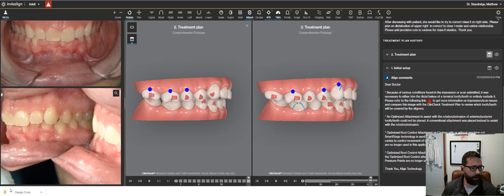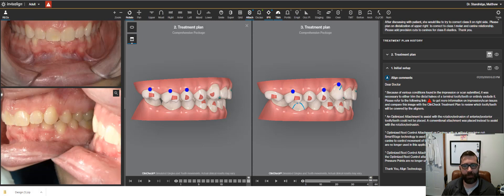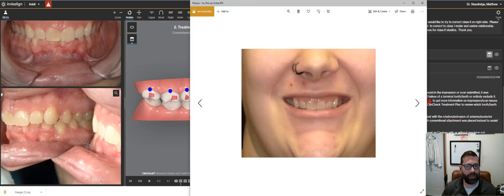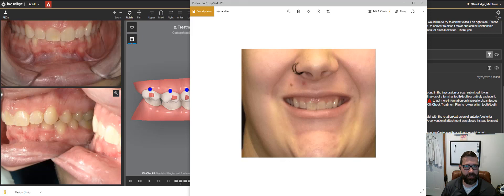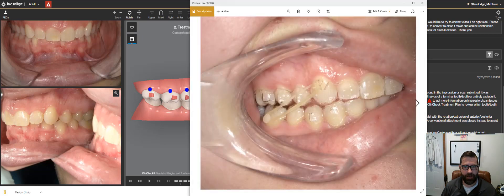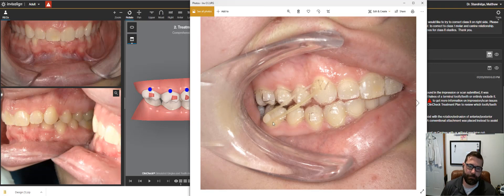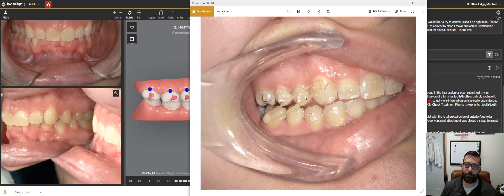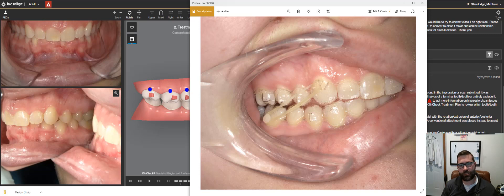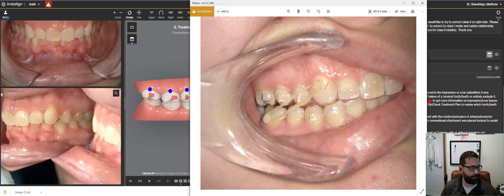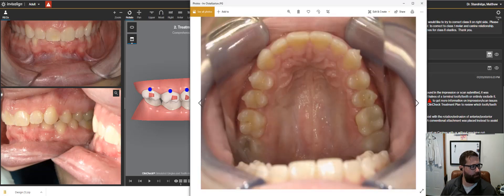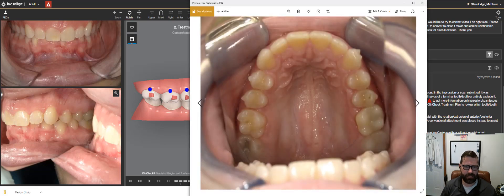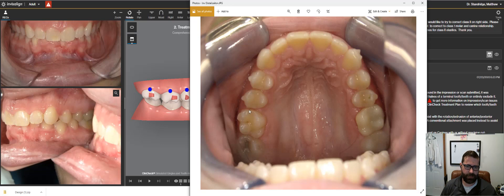And then let me bring up a photo. Also, we're going to be opening the bite by intruding these front teeth. Here's a smile. Right? And then here is it in action. So they have this cutout. I use a mini mold kit to do a composite button right there. Running a quarter inch medium class two elastic on this side. And we started that in September.